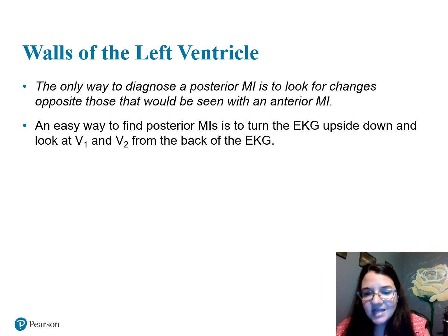Remember, how do you tell if there's a heart attack? ST elevation or depression. You have STEMI and you have non-STEMI. If I have ST elevation or depression, I am in the injury phase, or I could already be infarcted. It's going back to knowing your rules, knowing your age: your acute age, your age indeterminate, and your old age.